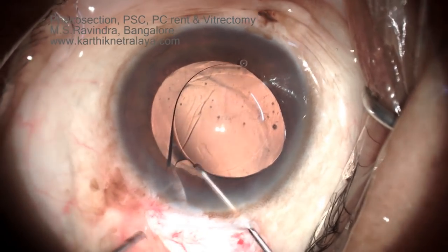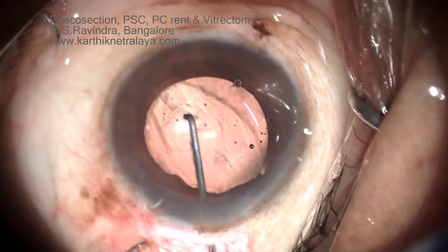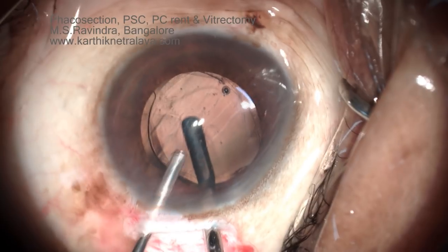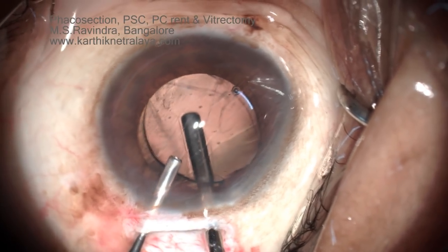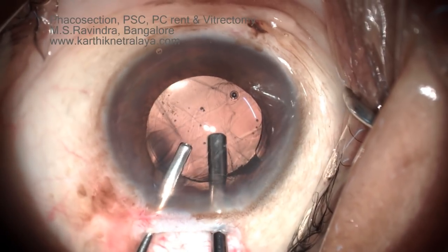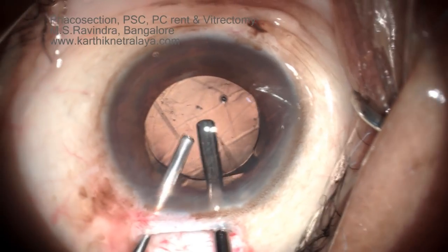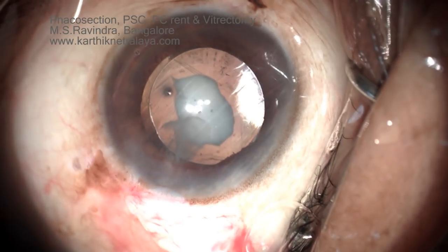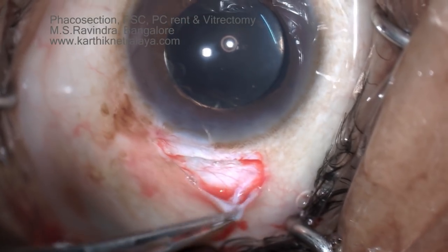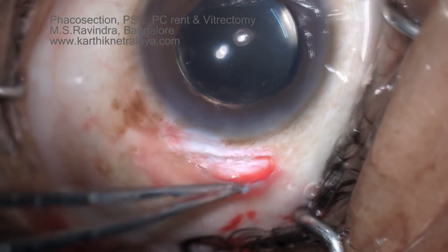The lens is placed in the sulcus due to the absence of an intact posterior capsule. This patient had diabetic macular edema, so a small amount of triamcinolone is injected into the eye, serving the double purpose of minimizing anterior segment inflammation and identifying vitreous strands from the posterior segment. The targets of avoiding cortical dropping, complete removal of cortex and herniated vitreous, and implanting an IOL have been achieved. The cause of the PCR was likely the bisection of the nucleus while one pole was still inside the posterior chamber — an iatrogenic complication.